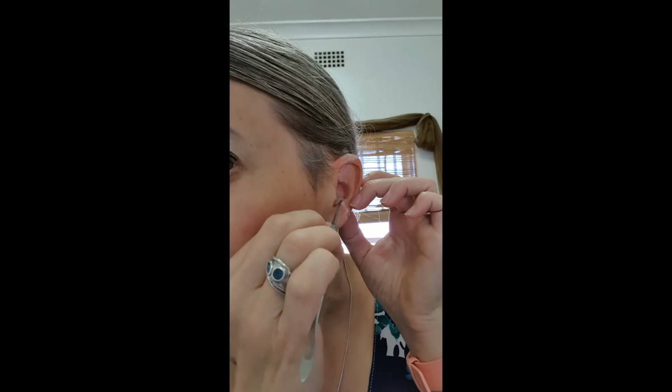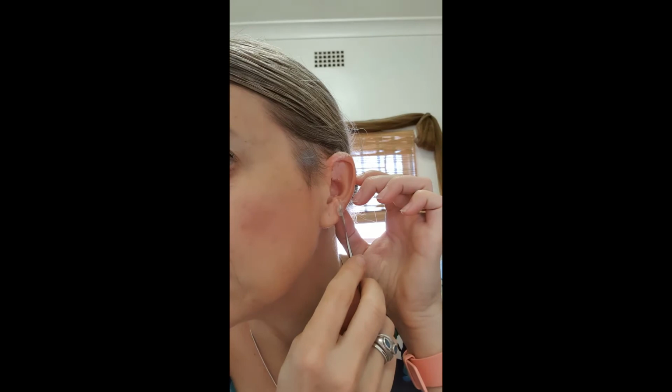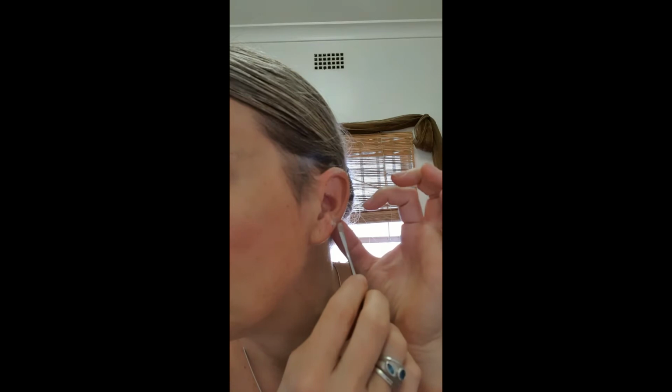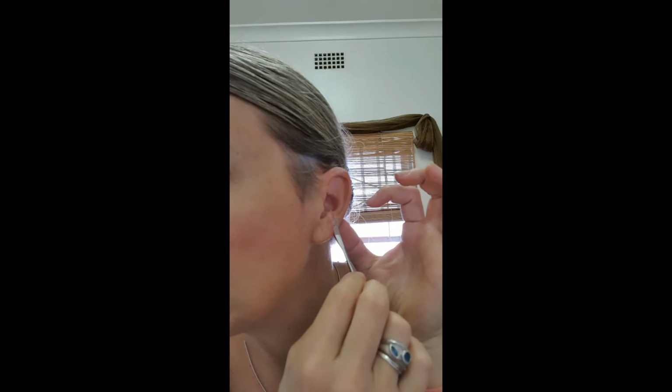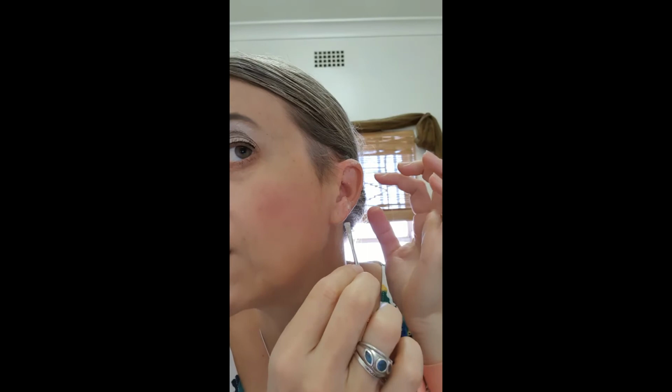We're going to hide it a little bit with the wax and try and hide this joint as much as we can. Let's have a look. The big thing is actually more the joint than the latex. The latex will go away. The latex does also help. It's a bit sticky, so it helps for this to stick properly on it. Okay, brilliant. Okay, just clean that a little bit. I just scrape it off on the edges. I need to clean my tools after this. We just close it up.